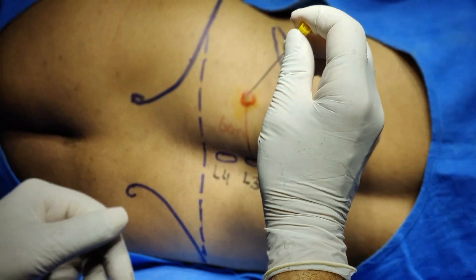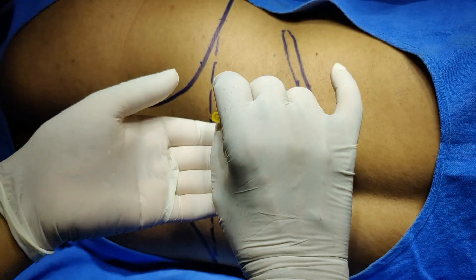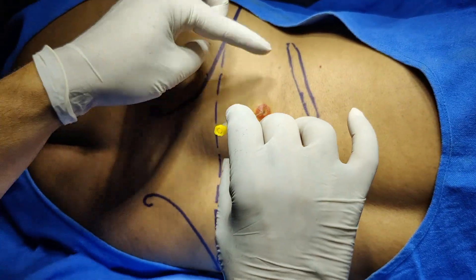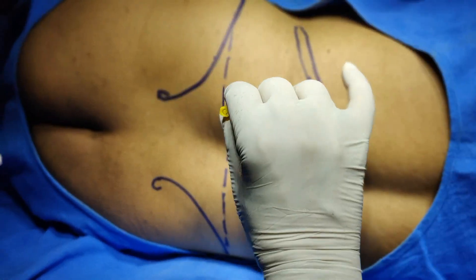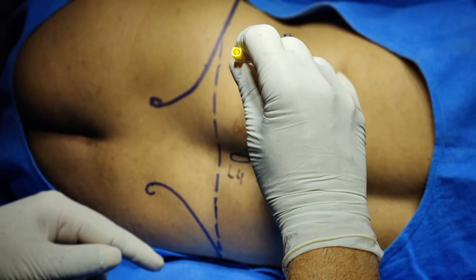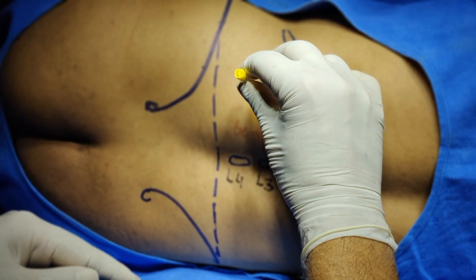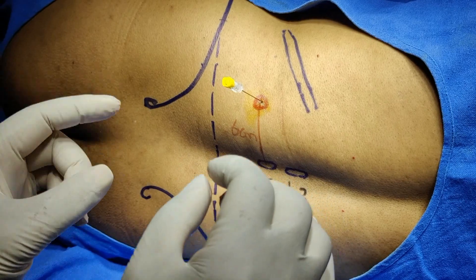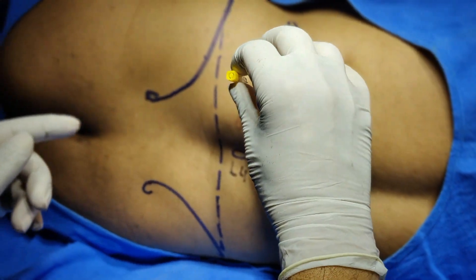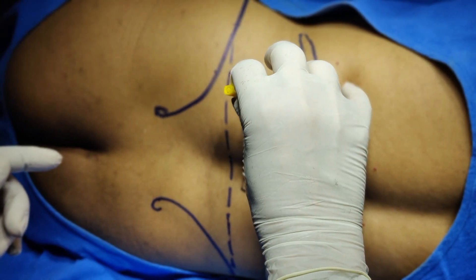Insert the needle from the same puncture point. The angle should be 80 degrees on one side and 100 degrees on the other, so tilt the needle slightly so that the tip is directed toward the midline. If there is any pain or discomfort, indicating the needle is touching a somatic nerve, withdraw the needle and tilt it cranially or caudally, then reinsert.